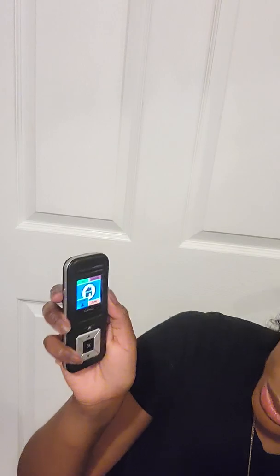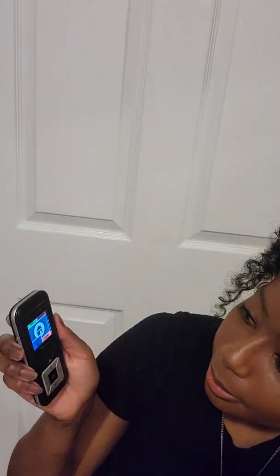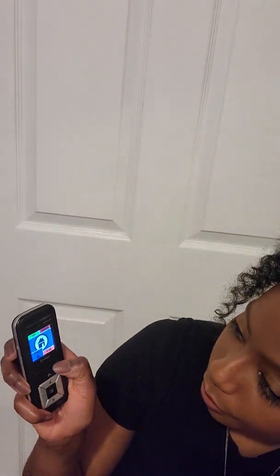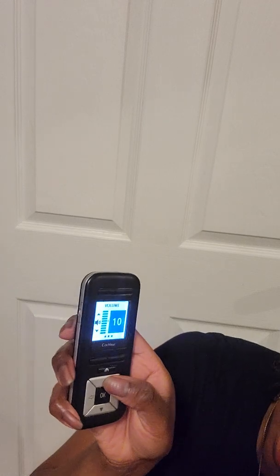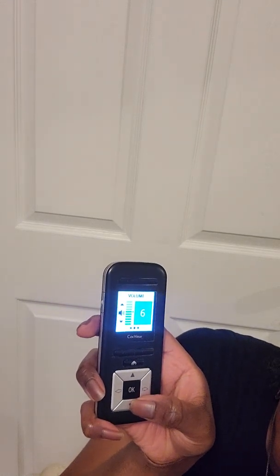So mostly I use home. It's always on this mostly. Seldom will I use the other settings, basically only when I really need to. So that's how that works. And then I'm going to go here. So that's the volume. It goes like this. I can turn it all the way down, but I like mine all the way up. It does not hurt my ear, by the way. It's totally fine.